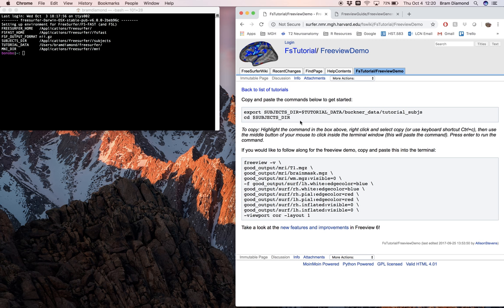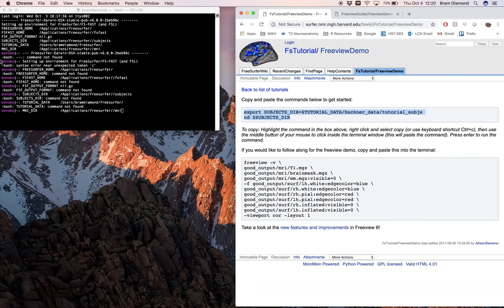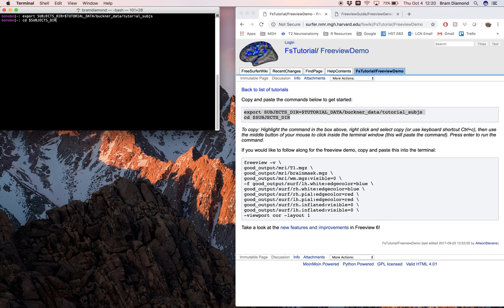The first thing you should do is copy over the first two lines and press enter to set the subject directory variable and change to that directory. This first line is creating this variable, which is the tutorial data — Buckner data tutorial subjects — and then we've changed to that directory. If you do print working directory, you should see that we're in the correct directory.